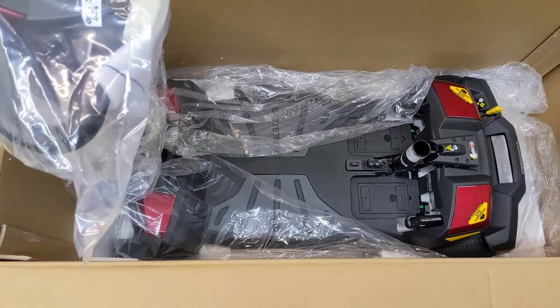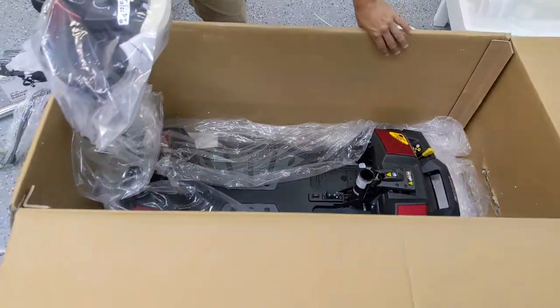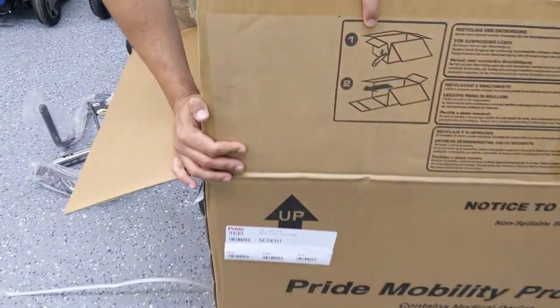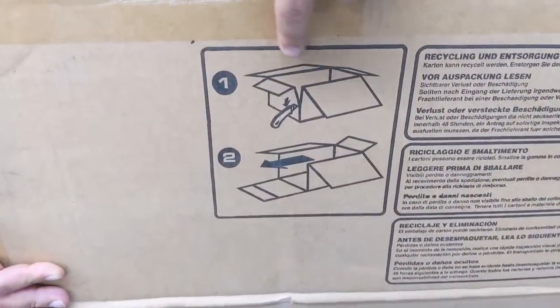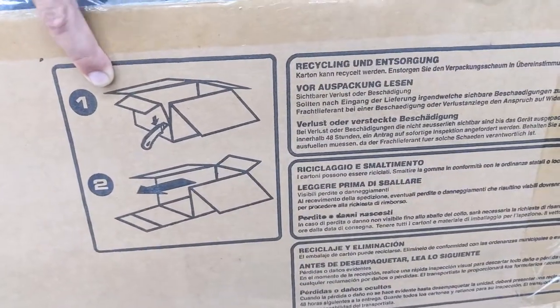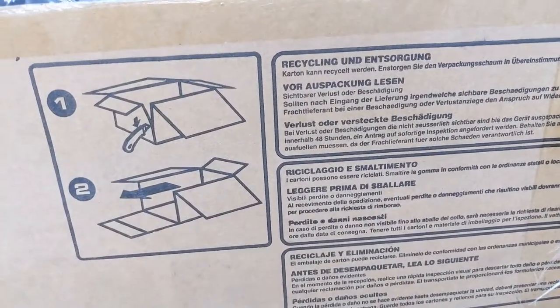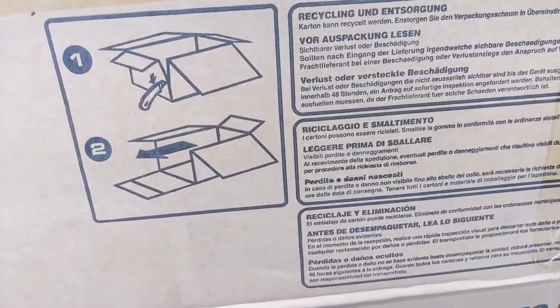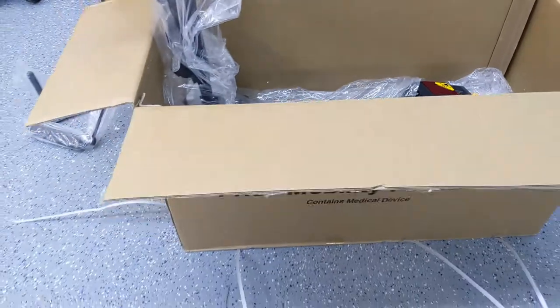At this point, I'm going to rotate the box because they actually instruct you to do this on the top of the box — it shows you in a diagram. Step one: cut the sides of one of the short ends of the box and then lay it flat. The reason they're telling you to do that is because you can roll the scooter right out of the box as opposed to picking it up.